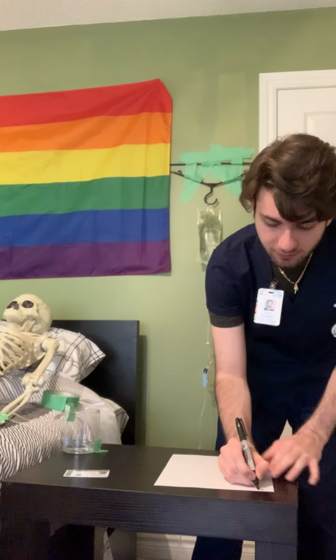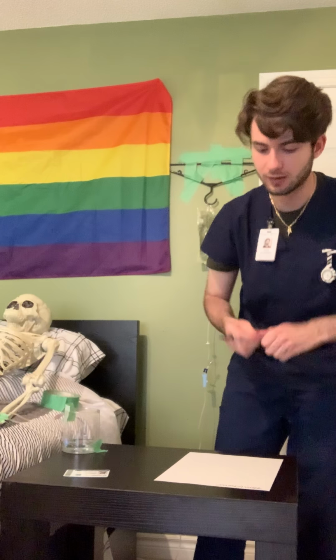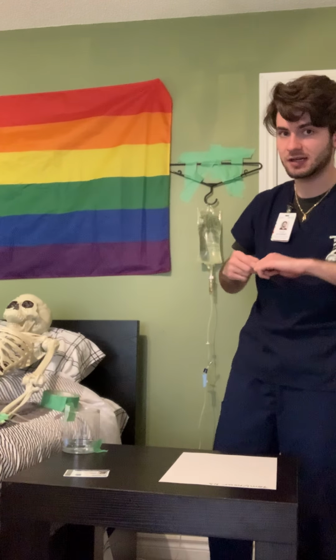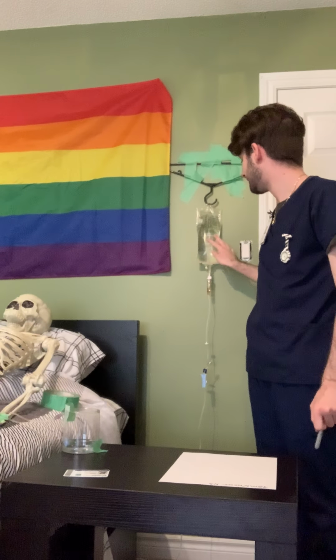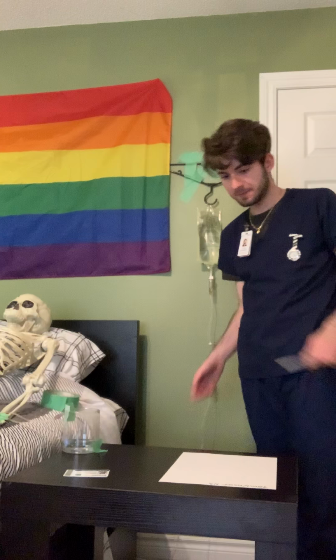The first thing I would do before starting a patient on IV therapy would be to check the physician's order, gather my supplies, and then enter the room. The physician has ordered 75 milliliters an hour of normal saline. So what I would need to take into the room with me is my 1000 milliliter bag of normal saline and the correct 10 drops per milliliter continuous flow IV tubing set.